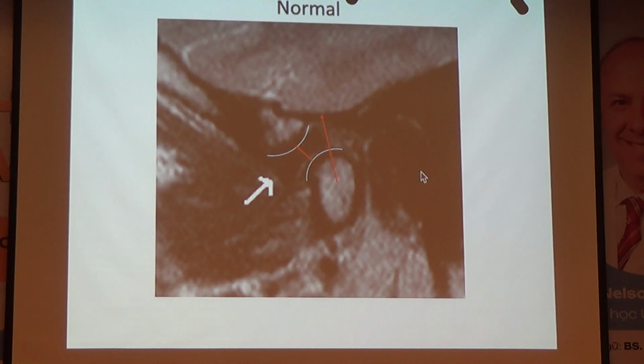Millimetric. But when you trace the condylography, the machine can feel this little movement.